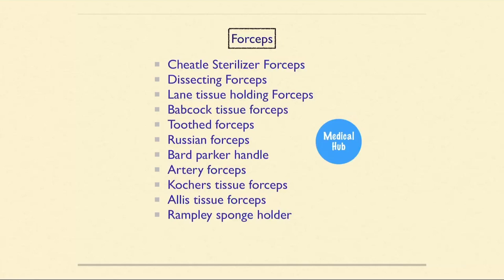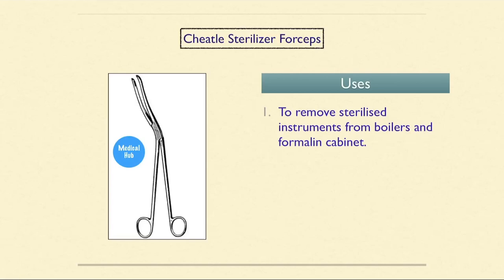Now we will discuss forceps, including: Cheatle sterilizer forceps, dissecting forceps, Lane tissue holding forceps, Babcock tissue forceps, toothed forceps, Russian forceps, Bard Parker handle, artery forceps, Kocher's tissue forceps, Allis tissue forceps, and Rampley sponge holder. The Cheatle sterilizer forceps is used to remove sterilized instruments from boilers and formalin cabinets.